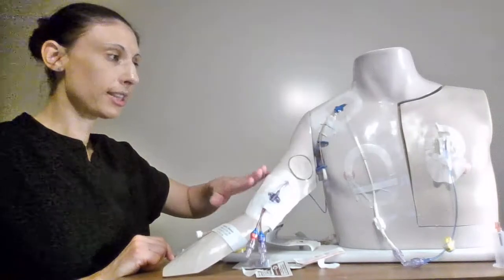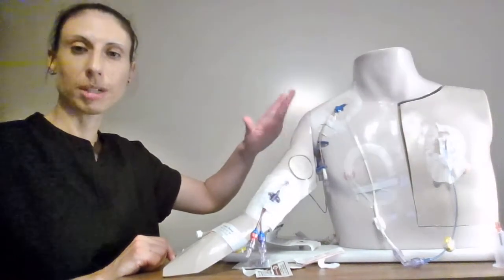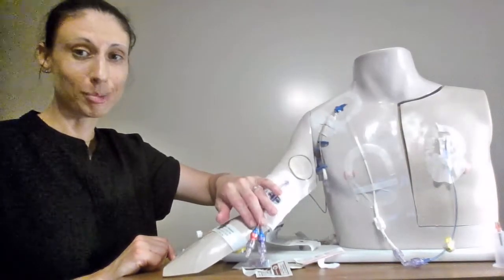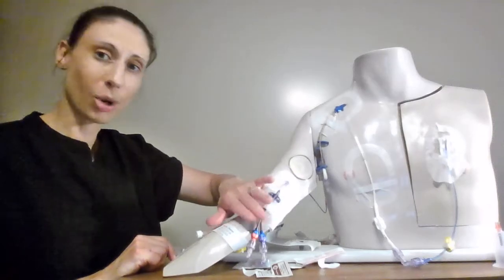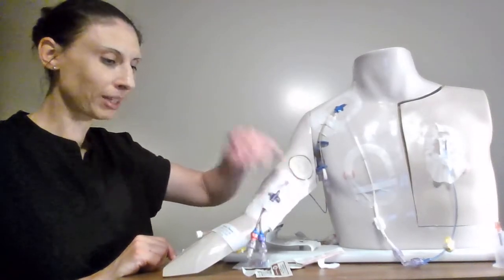Nice thing about the PICs is that there is a valve way deep at the end of the catheter to make sure that blood doesn't flow back and air doesn't go in when we take our caps off. So this makes things a lot easier because we don't need heparin and you can see we also don't have any clamps to deal with. So nice and easy.